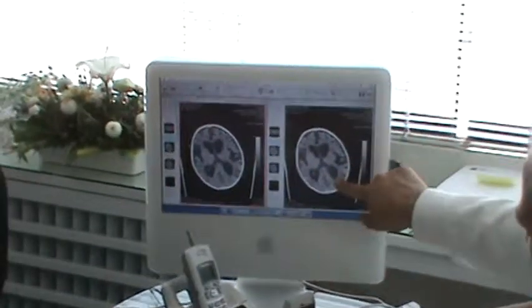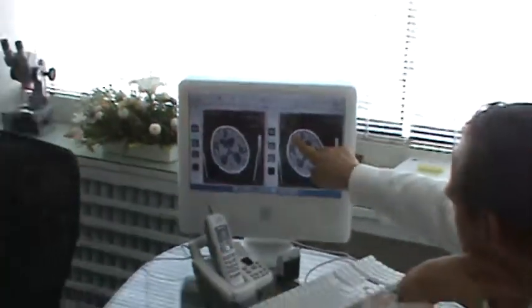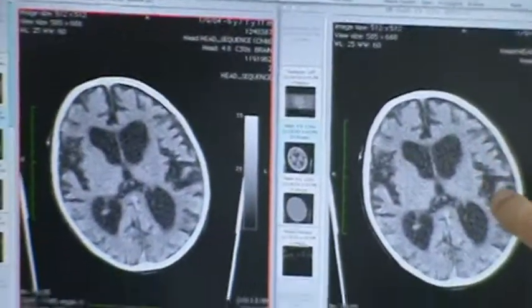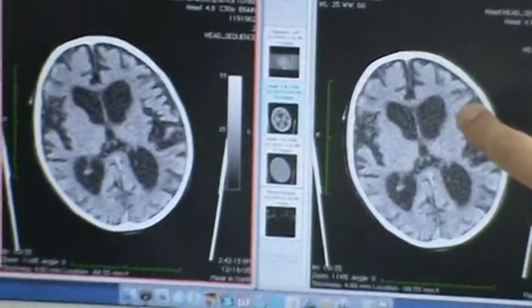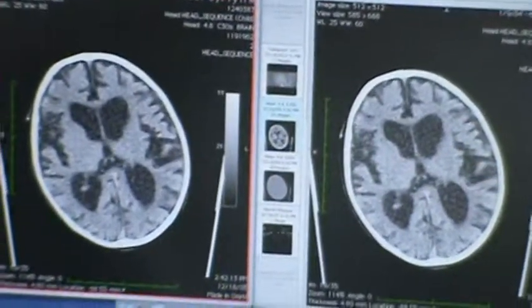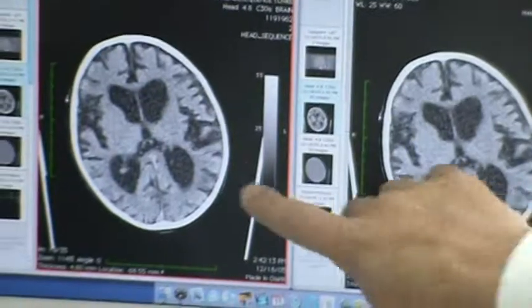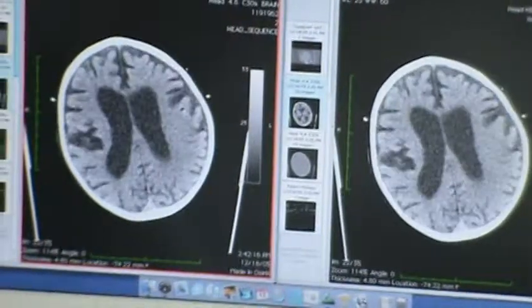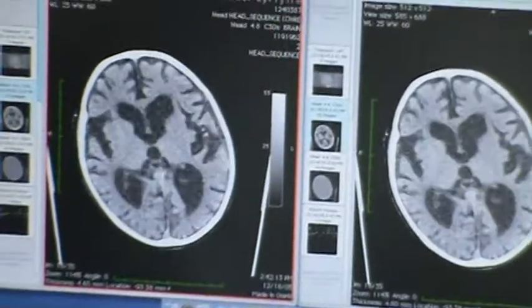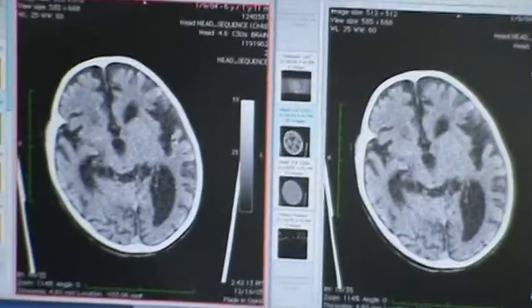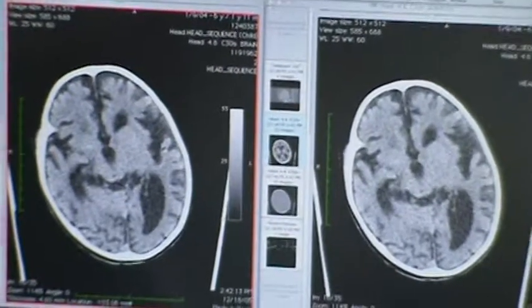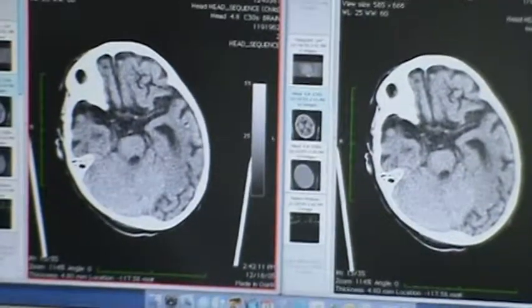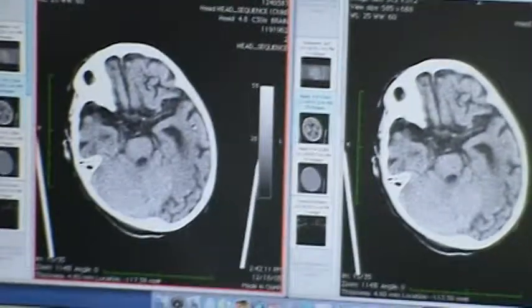The brain tissue is the grey one, and the black one is the space — the empty space in between the brain tissue. You can see that there is a lot of widening of the spaces. Normally it's a little more tight, more compact.